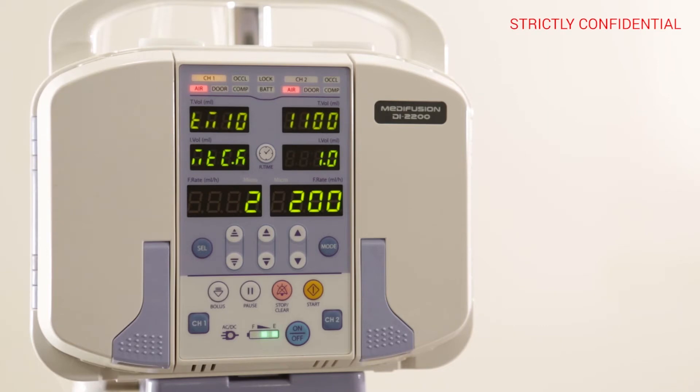For CHANNEL 2, activate CHANNEL 2 and follow the same procedure.